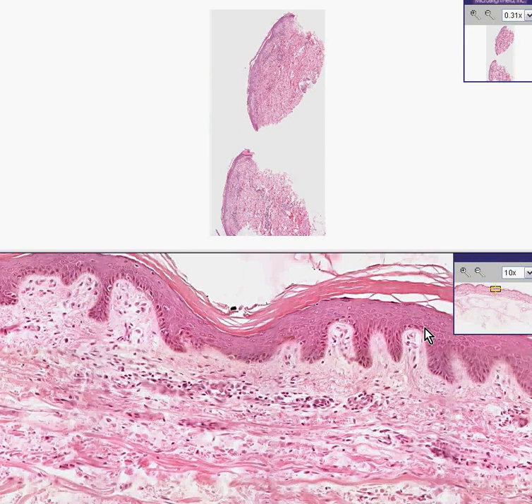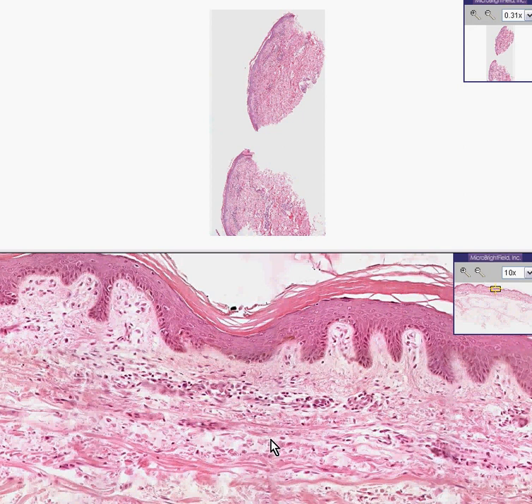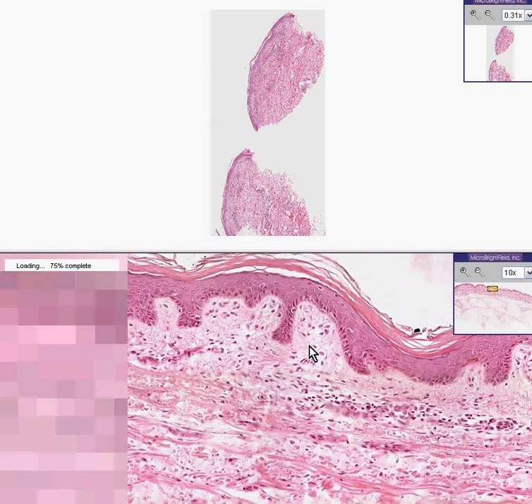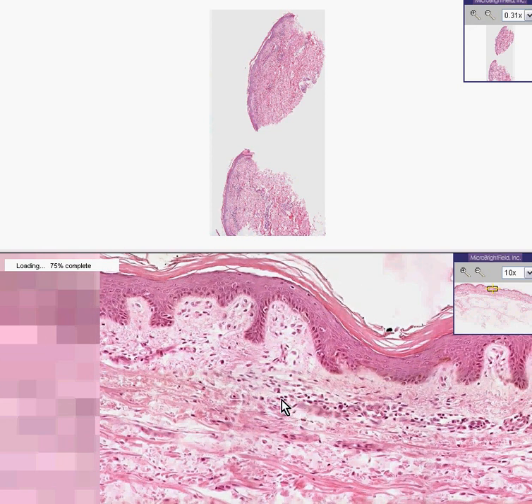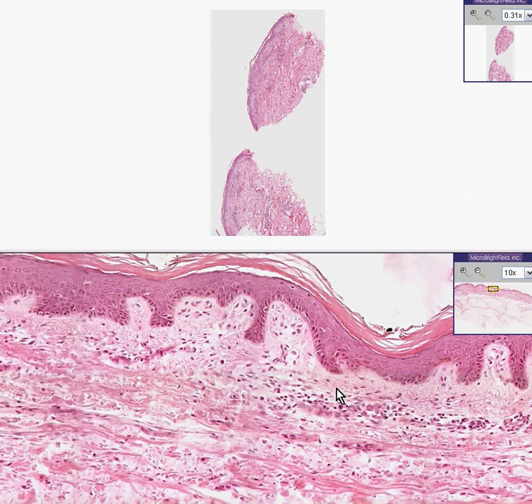Here is normal skin in the bottom field. Notice we have a loose papillary dermis, a thicker reticular dermis, and all of the classical layers of the epidermis. It is not uncommon for the papillary dermis, which is rich in blood vessels, to also have some occasional inflammatory cells scattered here and there — macrophages, perhaps a neutrophil, a couple of lymphocytes. This is a normal population of inflammatory cells of the dermis.